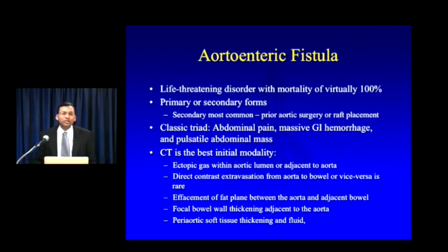And what are you looking for? Well, you would think that you'd be looking for contrast extravasation from the aorta into the bowel or vice versa, but the truth is you almost never see that. In fact, I don't think I actually have seen a case where I've seen contrast going directly from the aorta into the bowel, or maybe I've seen one case.